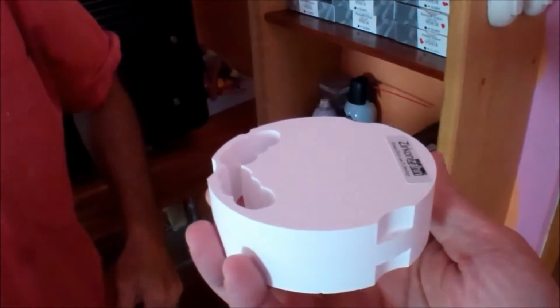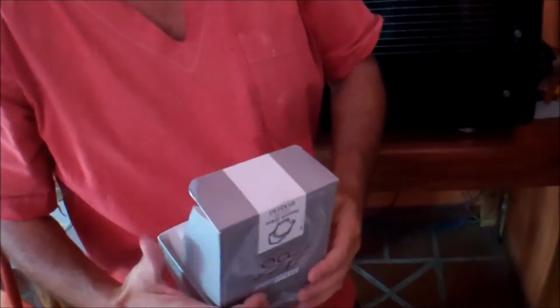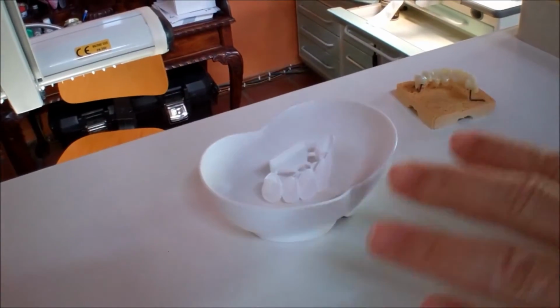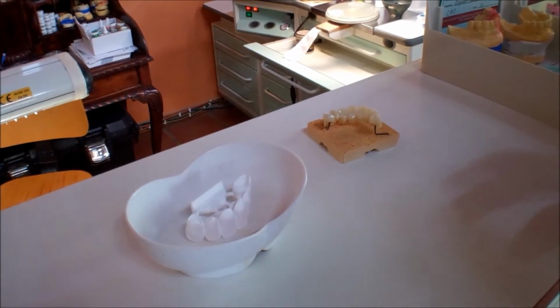Wow. And even the weight. Oh, I can hold it. Oh, wow. Wow, that's heavier than I thought it would be. Yeah. Now, is that a type of... Somebody said zirconia is a type of metal. It's a metal, it's true. It's a translucent metal, but it's a metal. If you take an X-ray, it shows white like the metal. Right. So this is how it comes out from the milling machine. Then I go and do the painting through capillarity of materials.